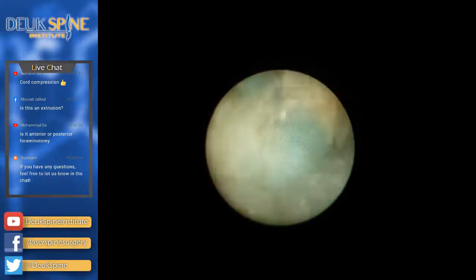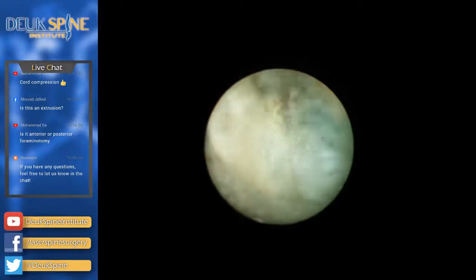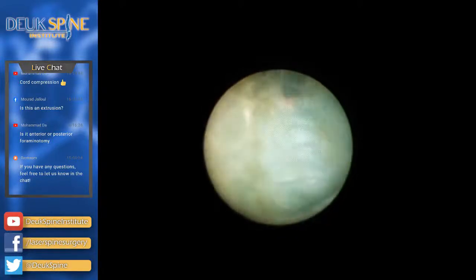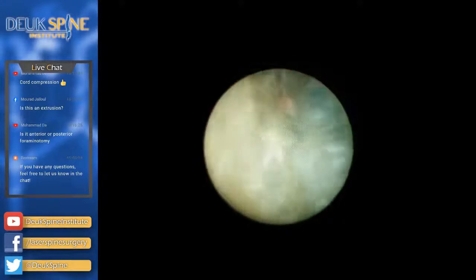Imagine if I said to you, I'll fix your knee, but I got to take half of the knee joint out. If I got to remove half of the bone in your knee, it's obvious that means we're going to destabilize your knee. It's never going to be the same again. It's going to be weaker, more prone to injury. By the way, this is the herniation I'm taking out.